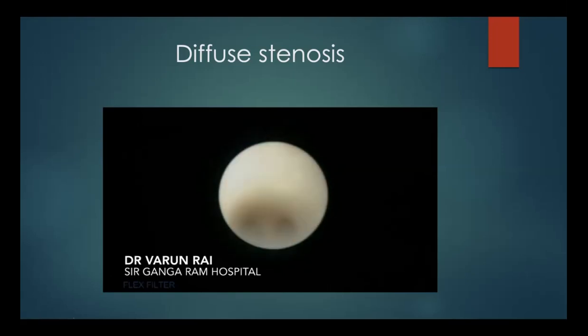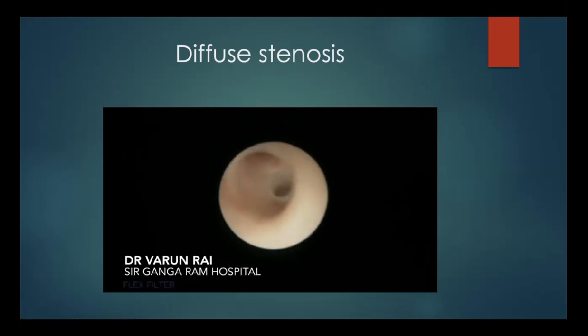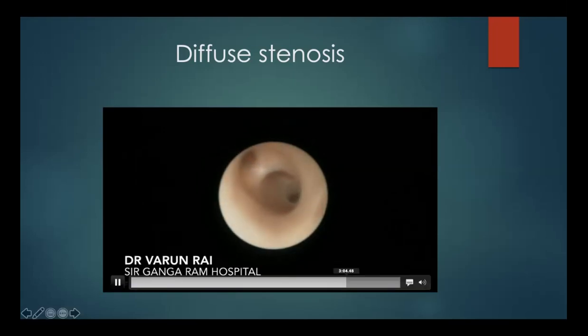Now we are able to see the tertiary branches as well, which appear almost all right. And these are your fourth level branches. And it's only when you're withdrawing the endoscope that's the time you can really make out what you have achieved so far, as in the previous case.